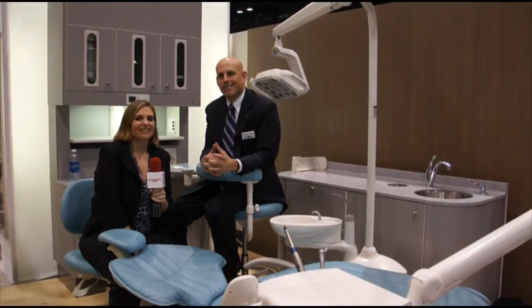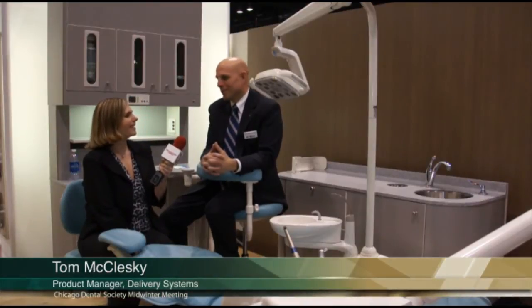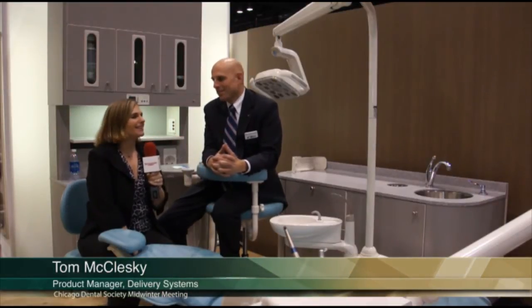Hi, I'm Ali Cook of Dentistry Today, coming to you once again from the Chicago Midwinter Meeting. I'm here at the ADEC booth with Mr. Tom McCluskey, who is Product Manager at ADEC. Tom, it's nice to meet you. Nice to meet you as well. And what product are you showcasing today?